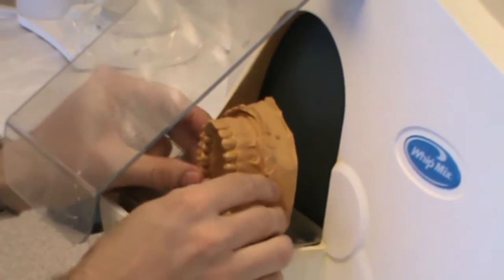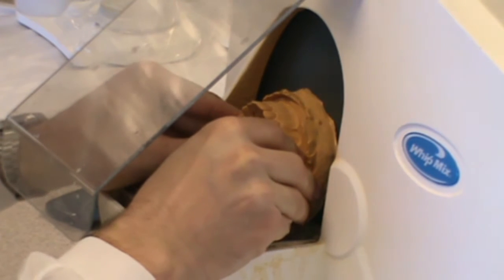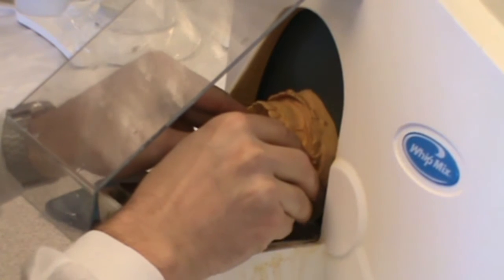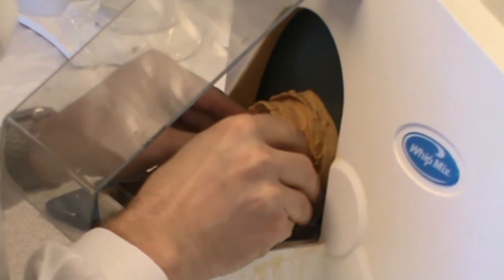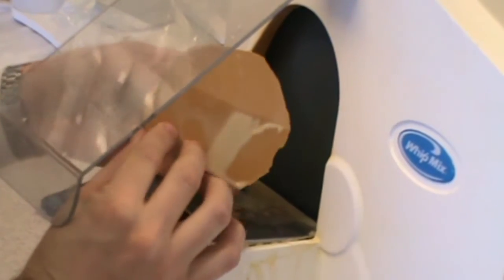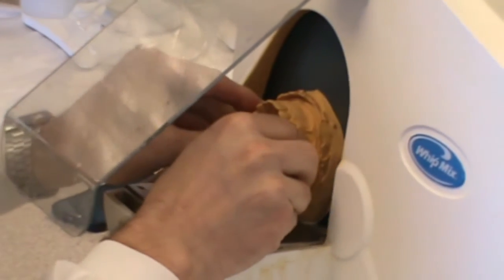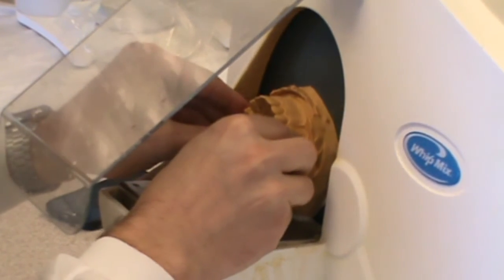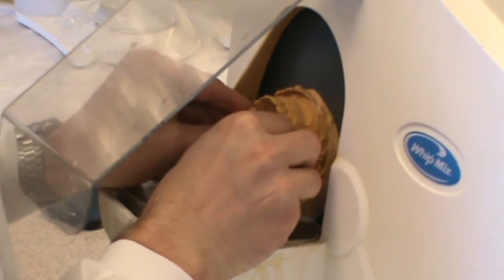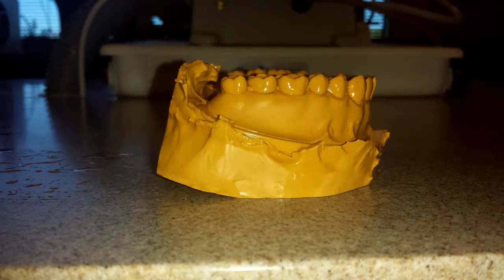I'm not trimming it all the way to where it's going to be finished, but I'm trimming it so it's a flat zone so I can trim the bottom of the cast. As I trim the bottom of the cast, what I'm trying to do is hold the occlusal surface completely perpendicular to the table of the trimmer. I don't want it to be slanted to the right or to the left. In this case, I'm having to trim more in the anterior, and I'm watching that line move more to the posterior so I'm more confident I'm holding it at the same angle. I'm looking down at the top of the cast to make sure the occlusal plane is perpendicular to the table.